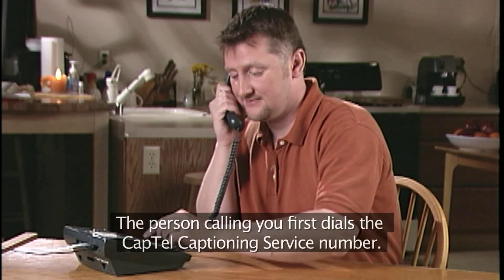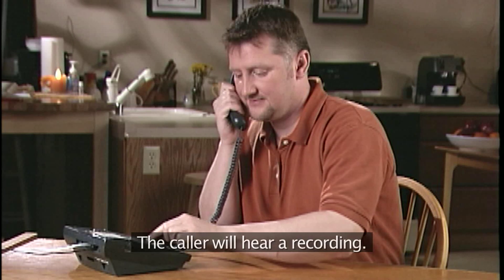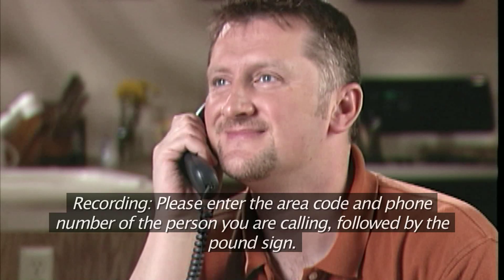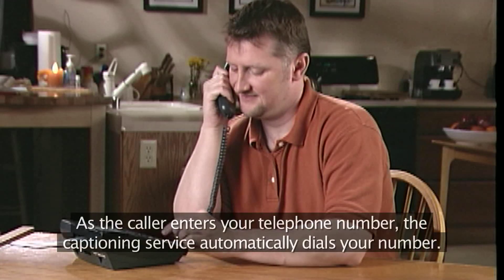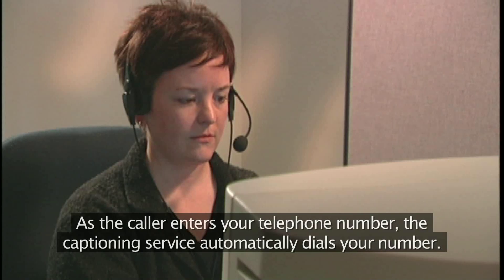The person calling you first dials the CapTel captioning service number. The caller will hear a recording: "Thank you for calling the Caption telephone service. Please enter the area code and phone number of the person you are calling, followed by the pound sign." As the caller enters your telephone number, the captioning service automatically dials your number.